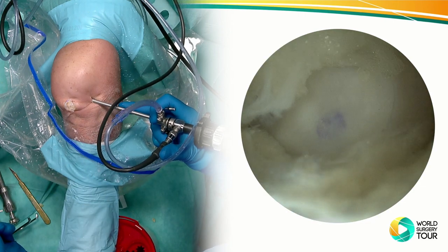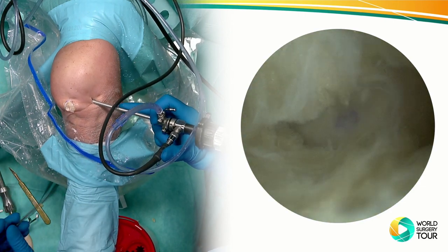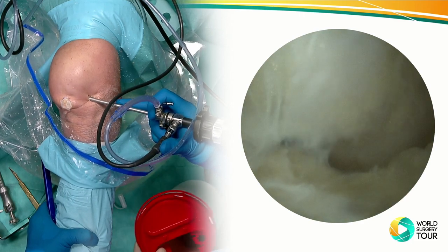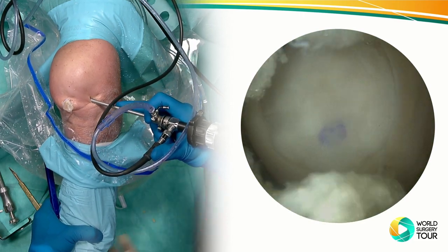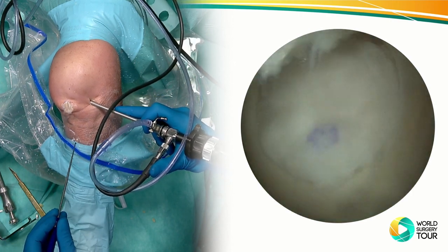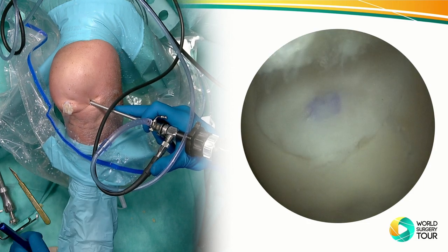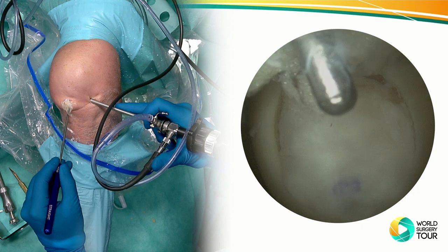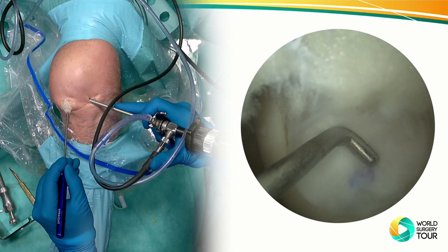Now I'll take the palpation hook again to show you. Actually, maybe you can bend it a little bit. Take this pot away. Okay. Stephen, take it, please. So now you can still have a little bit of option and bend it a little more. Extend. Sorry, my mistake. Extension. See, if you now see a little bit of room, you can still move it slightly.